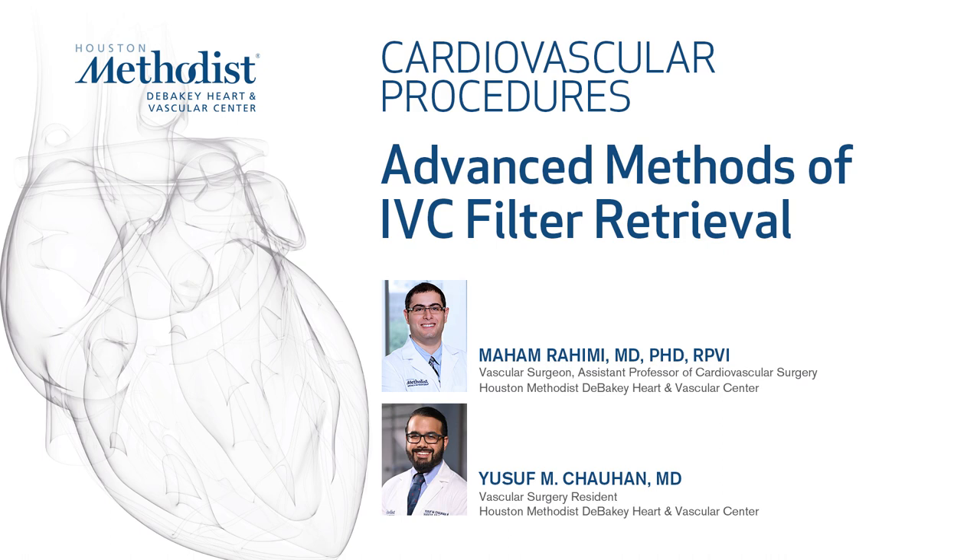This video demonstrates various advanced techniques for the endovascular removal of inferior vena cava filters. We will begin our demonstration with the tools necessary for removal of these filters.